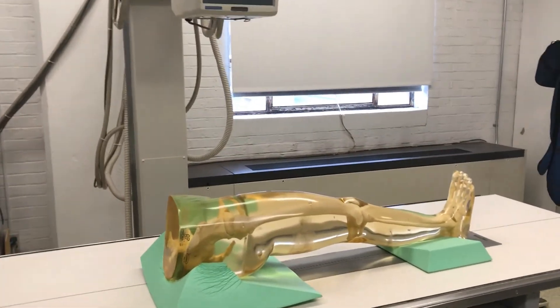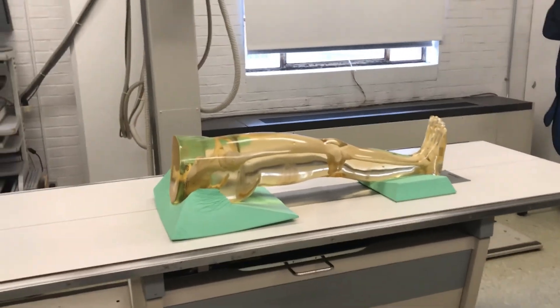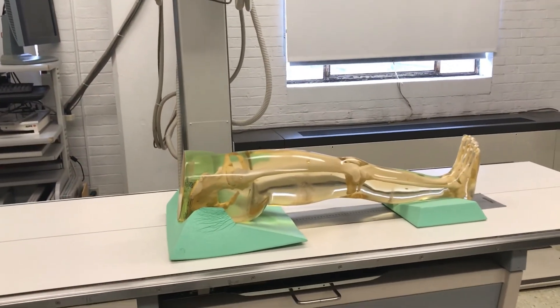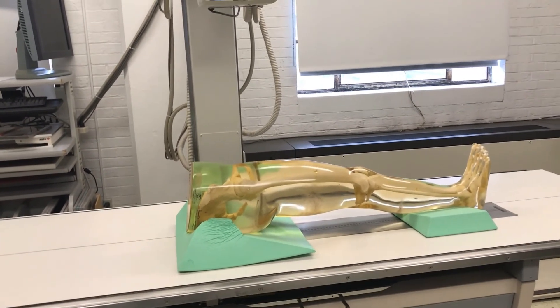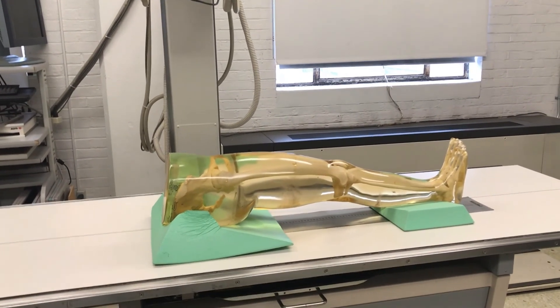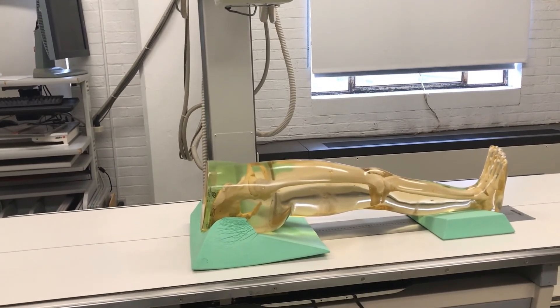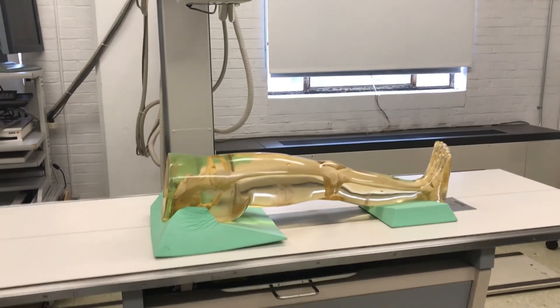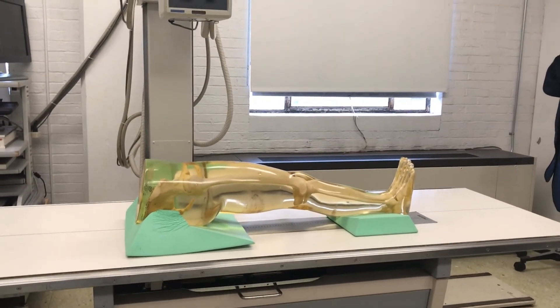I'm just making a quick video for you guys because you will be missing me for this leg length demo. We don't do these too often. You have two options — there's one routine for DR equipment and a second setup for CR equipment. Here at the school we have CR equipment.